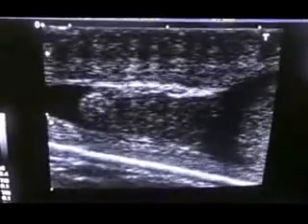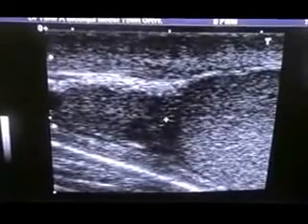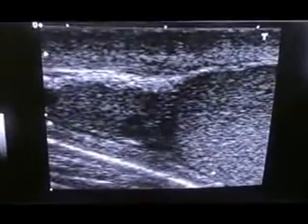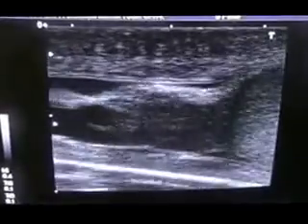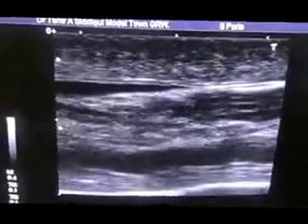This is the status of the right testis. This area is the epididymis, this region is the epididymis. This is the wall of the scrotum, which is normal and not thick.